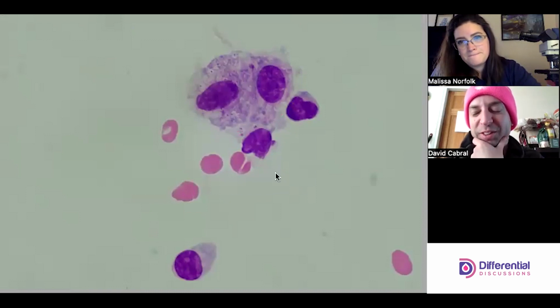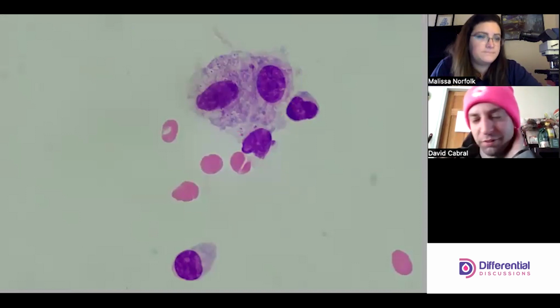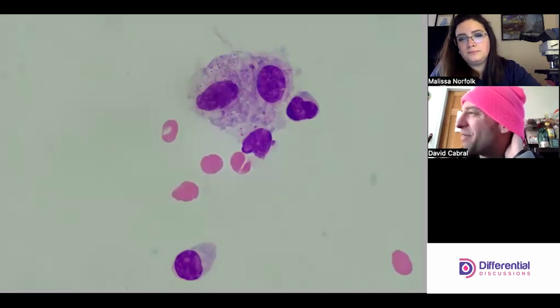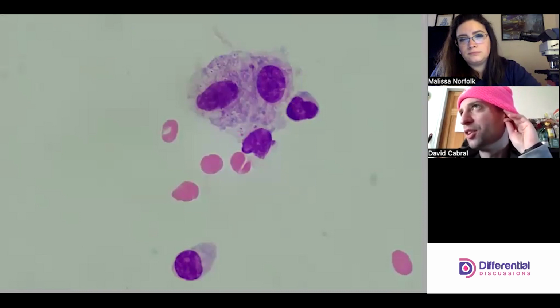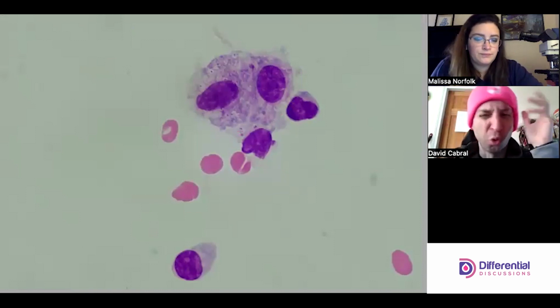It is difficult. There's always a little bit of being on the knife's edge about a call that goes one way or the other. We've had two or three cells that could have gone this way or that way, both normal categories.